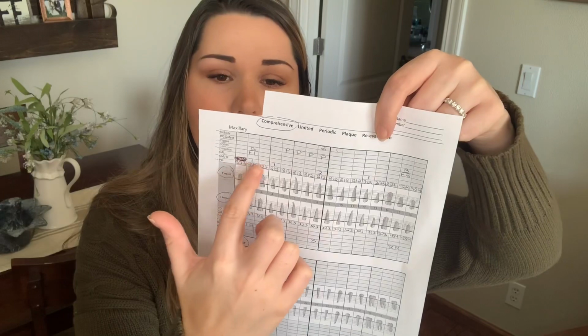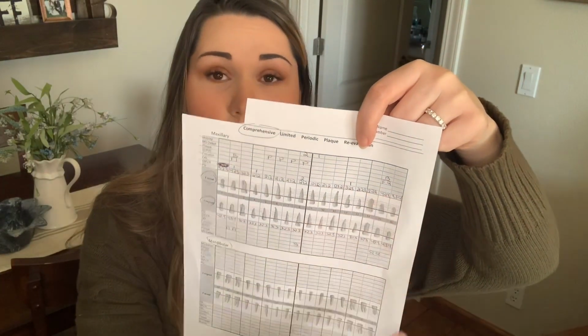So the hygienist will usually start with the pocket depth of the tooth. Now that's 3 measurements per side of the tooth, so 3 facial readings and 3 lingual readings. She's going to start usually on the facial side of the tooth, and she's going to go all along the facial and give you 3 numbers per tooth. Now this reading can range anywhere from a 0 to a 12. Good healthy gums are 1 to 3.